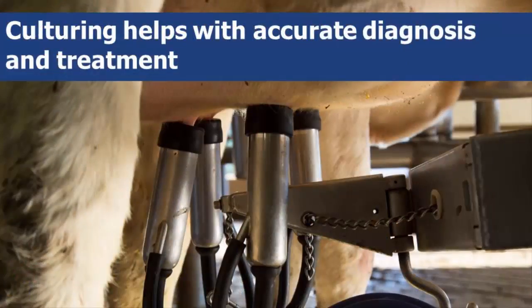Mastitis is common and its treatment can be costly. The many different types of bacteria and their individual treatment courses can complicate treatment. In order to minimize misdiagnosing bacteria and subsequently misusing antibiotics, the on-farm culturing process you just completed has provided you with the proper information to accurately determine which bacteria is or is not present in the milk of your dairy herd.